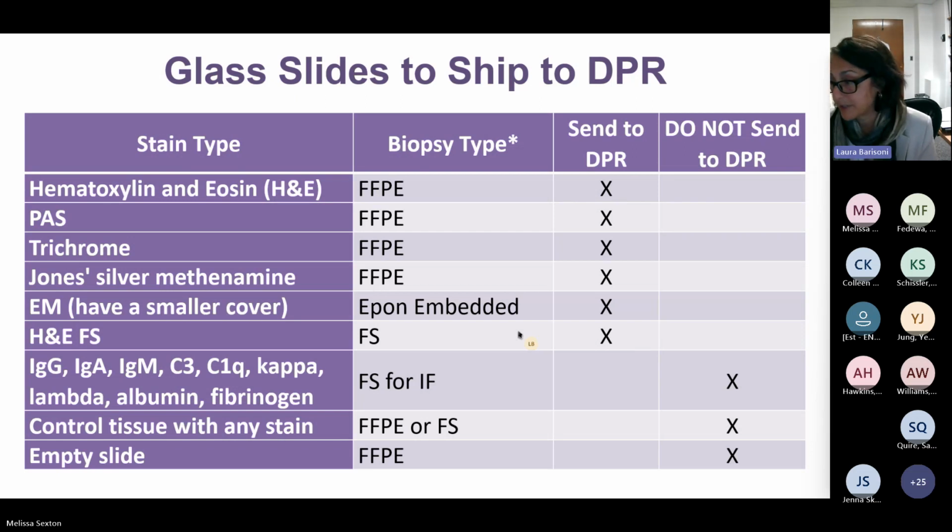And we can't see them, because you can see them only on the immunofluorescence. So if you think about it, the scanner can scan tissue that it can see, not tissue that it cannot see. If you hold up the glass slide and you don't see anything, you don't want any glass slides that look empty.